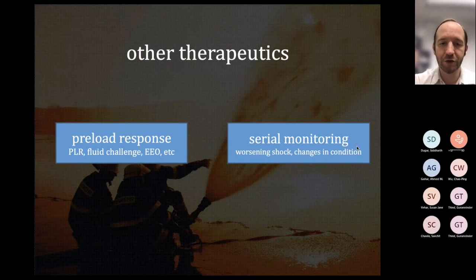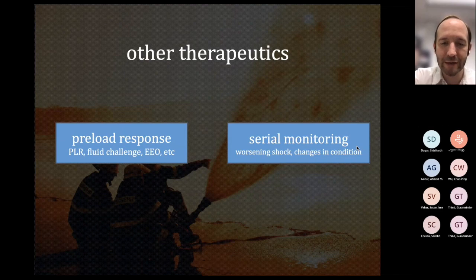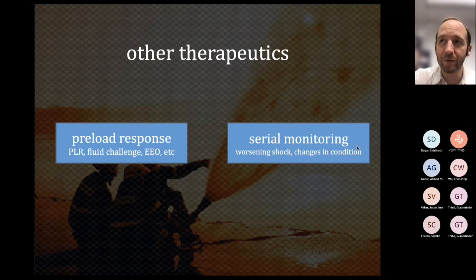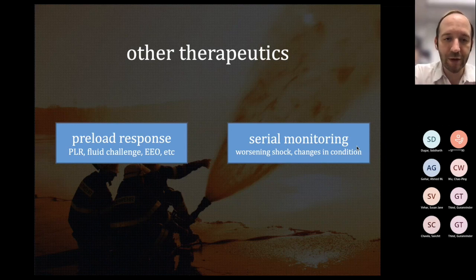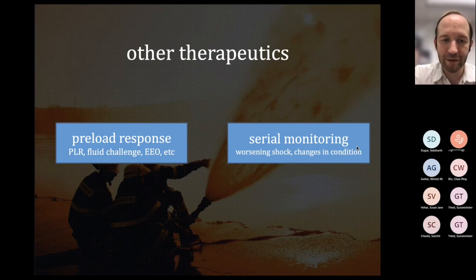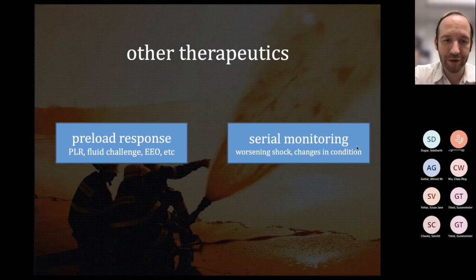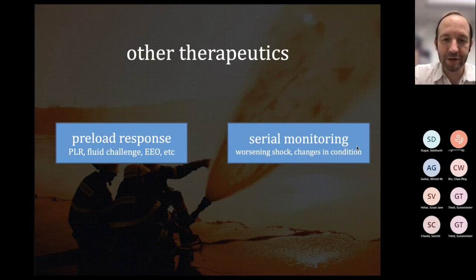Other therapeutics where you might use serial measurement of LVOT VTI or cardiac output: for assessing preload responsiveness, there are very few things reliable in every circumstance except actually measuring cardiac output, and most of the time we don't have a cardiac output monitor except for echo. So if you have reliable images, you could do a passive leg raise and measure before and after, and once you've returned the patient to the original position. You could do a fluid challenge and actually measure it while the fluid's going in. An expiratory occlusion test is another option if the person is relatively passive on the ventilator.